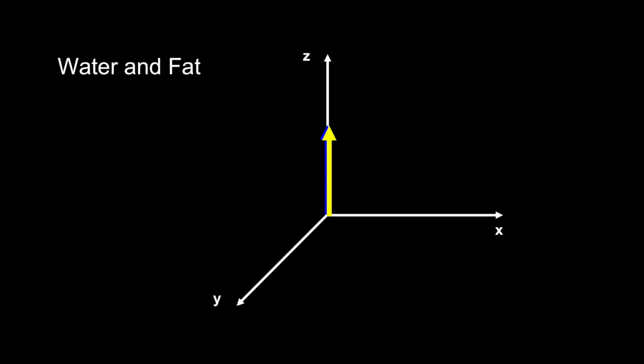Now, in order to create MRI images, the MRI goes through a complex set of precisely timed manipulations, RF pulses, gradients, etc., called pulse sequences. We're going to go over some pulse sequences commonly used in abdominal imaging in the next section. But these pulse sequences are what are run to get you all of the images that you end up looking at on the workstation.